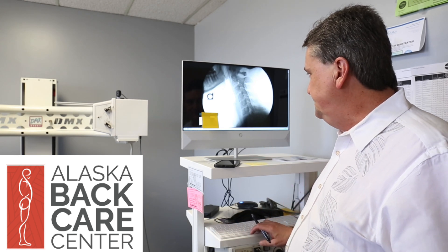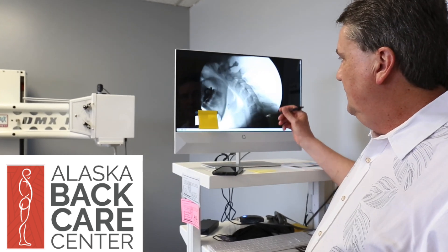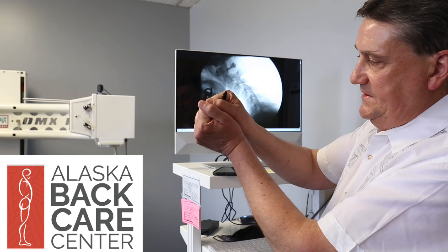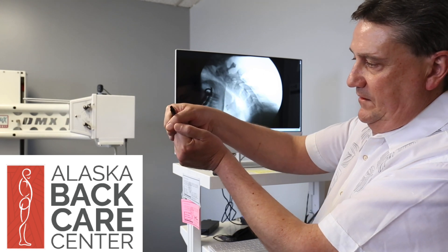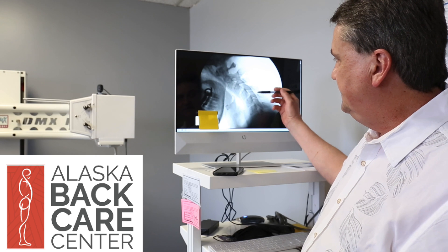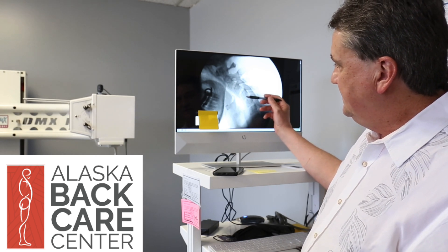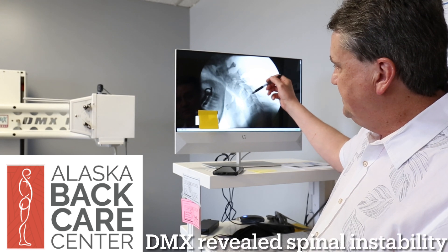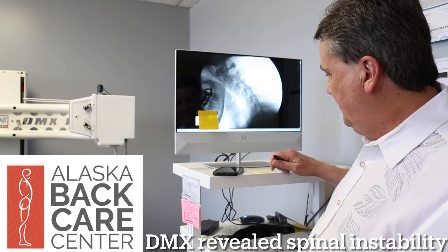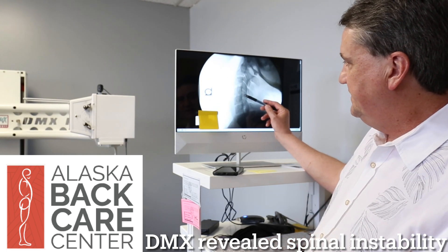What we're going to show you is what it looks like when you look at the x-ray screen. When she's bending down, what we're looking for is one bone sliding over top another, or if they're fanning out in the back. As you can see in this image, there's a gap here and this bone has slid forward just a bit if you line these bones back up. That's where she's having most of her problem, and you can see in the motion that that's where it flexes the most when she goes into flexion.